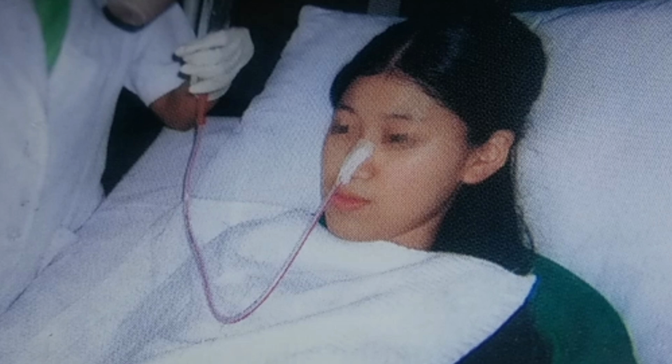If there is doubt about the tube placement, inform the physician and obtain an order for an X-ray. If you are aspirating and the stomach content is not coming, that means some misplacement has happened in the Ryle's tube. Immediately we have to inform the doctor and do an X-ray. Why do we do an X-ray? Only in an X-ray can we identify where the NG tube is present. In the Ryle's tube there is a small straight line, a radio opaque line. When we take the X-ray, we can see the radio opaque line, so we can easily identify where the NG tube is. If it is going without any problem, the NG tube is placed in the correct place.